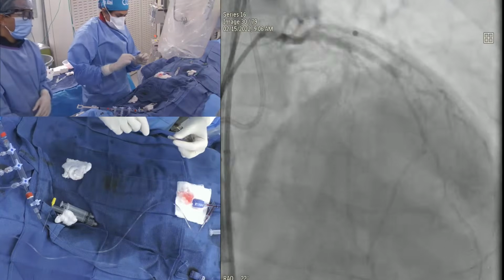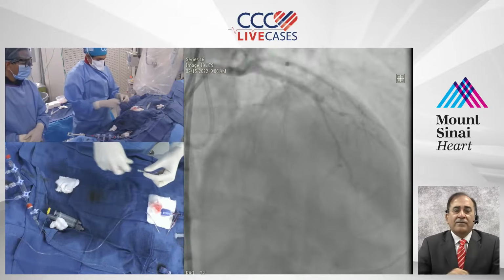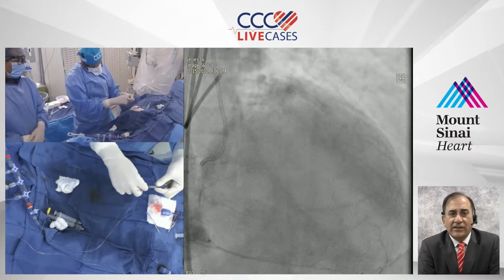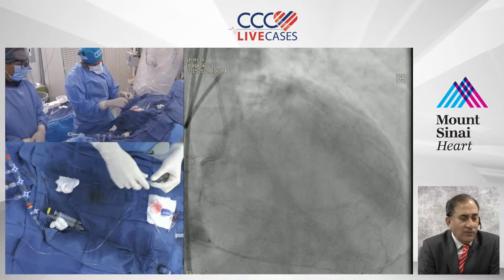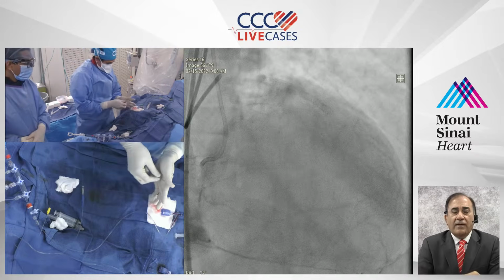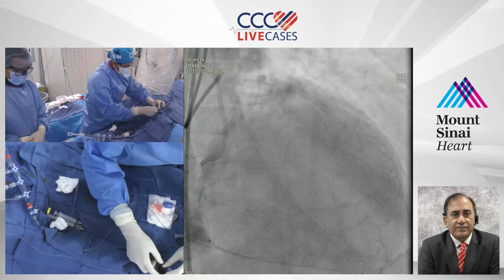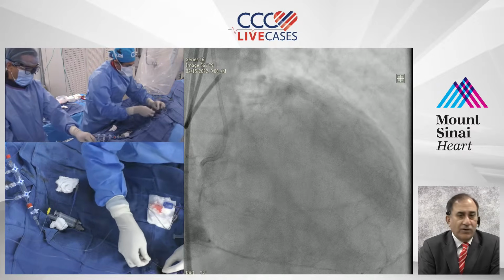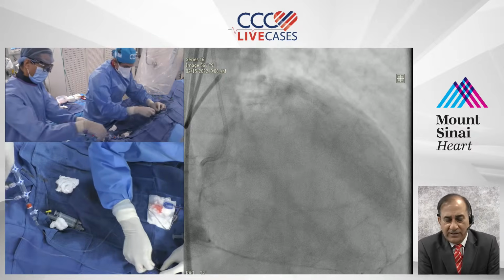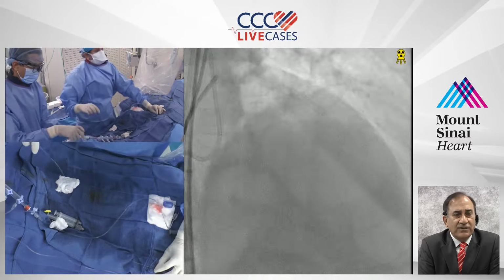And as you have continued to proceed with the retrograde, with how the antegrade looks, you're not going to be interrupting the anticoagulation yet. No. ACT is 270. And is it bivalirudin or heparin? We are on heparin. And the patient is on Plavix. Got it. What is your use these days of the percentage of bivalirudin versus heparin?